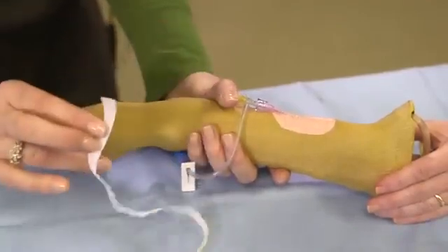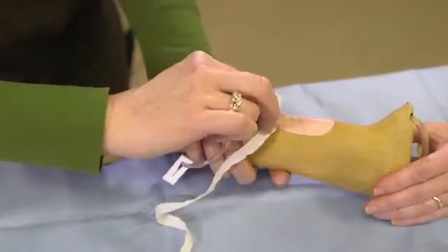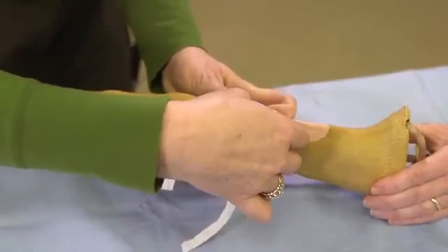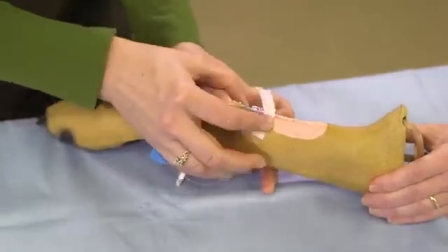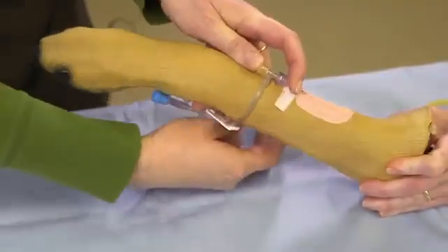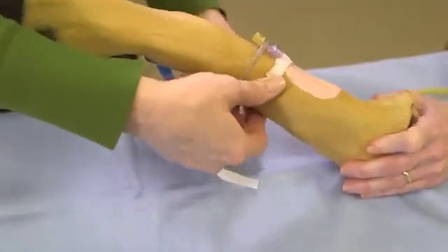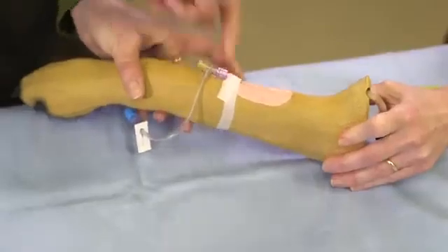You can use your thumb to lift up the catheter, go under your catheter, sticky side up, and then you're going to bring this, you can use your finger over here to stabilize that. Make a little wing, I call it. Get it nice and secure around that catheter. This piece of tape is actually the one that's really holding in your catheter. Bring it around. Again, tape can sometimes be your friend or not. And this should be coming up and around, over your catheter, and onto itself.